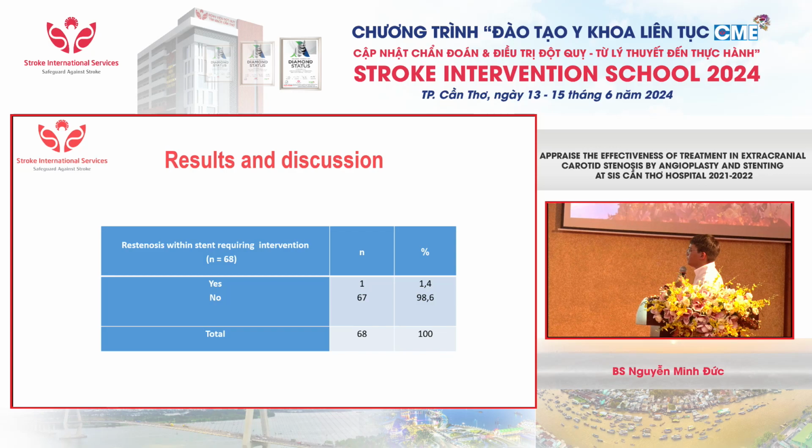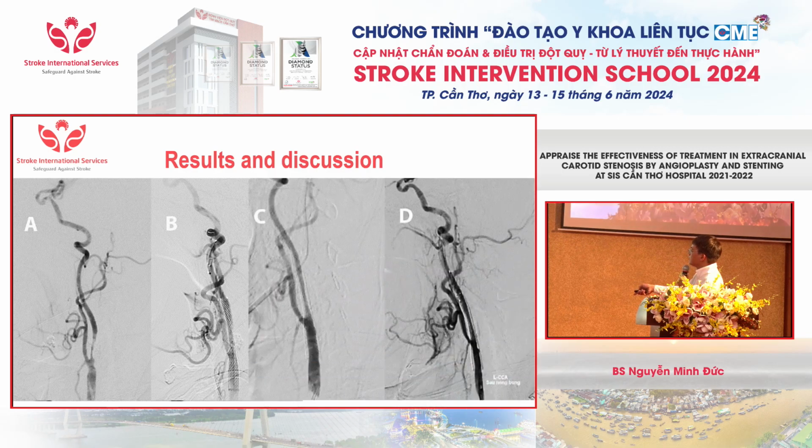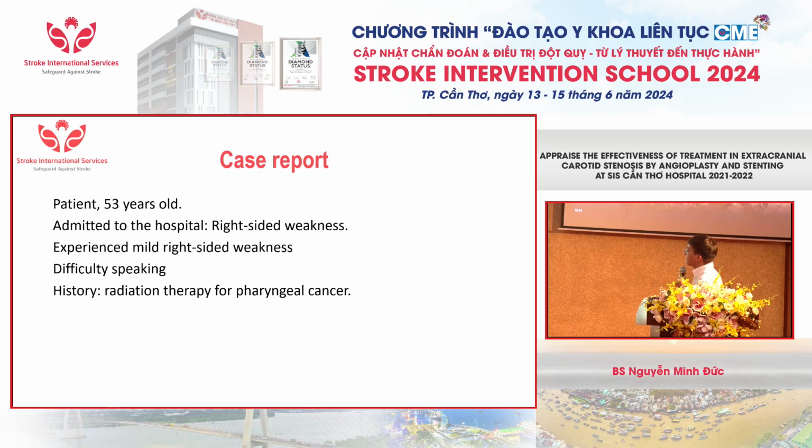When they came back for a check, we found restenosis that required intervention. We just performed balloon angioplasty, with no need to place a stent.